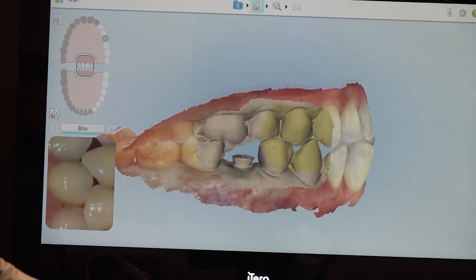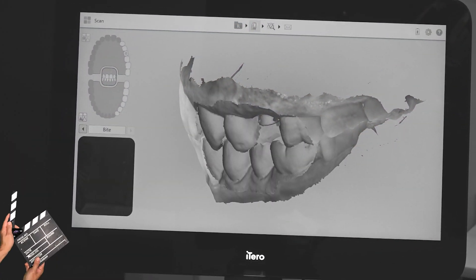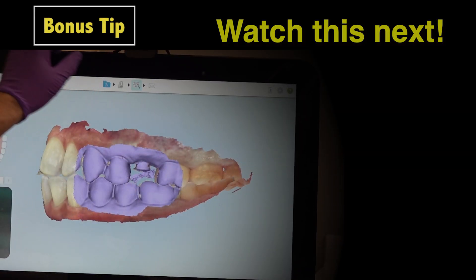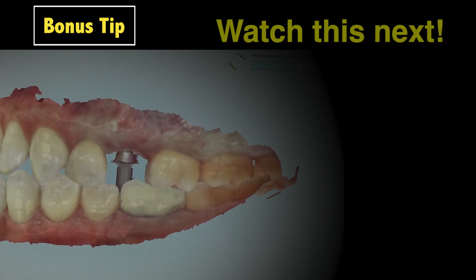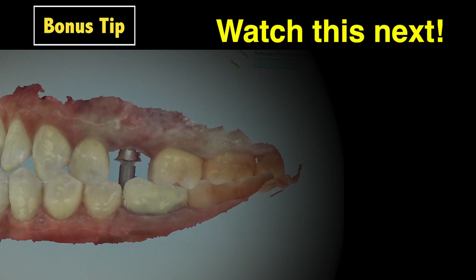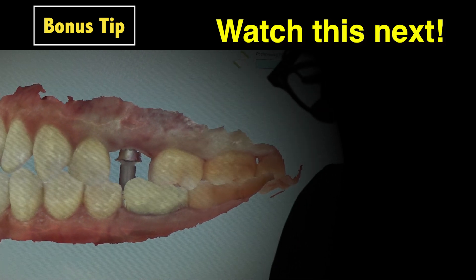The patient's bite is then recorded to ensure the scan body does not interfere with the bite scan. The scans are then processed and assessed one final time before submitting for fabrication of the screw-retained restoration. Remember, before capturing an implant impression for a screw-retained crown, check the path of insertion — it will make delivery day much easier for you and for your patient. This is Dr. Taylor Manolay with Glidewell. Thank you for joining us.